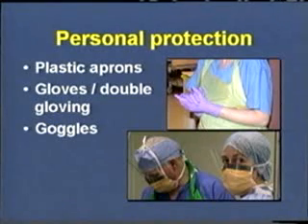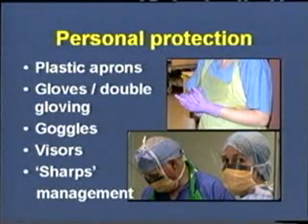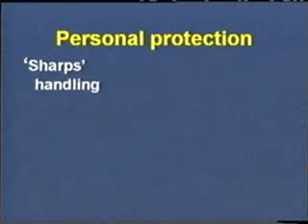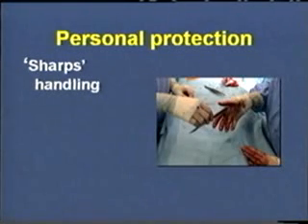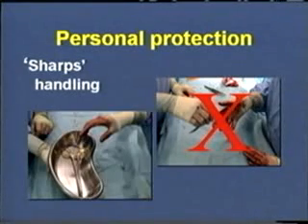Notwithstanding the use of protective equipment, it is very important that surgeons and nursing personnel, particularly those at the operating table, take special care with the handling of sharps. Great attention should be exercised in the transfer of sharp instruments from one individual to another, and no two individuals should handle the same sharp instrument at the same time. This transfer is most easily achieved by placing the sharp instrument into a bowl or kidney dish for handover.